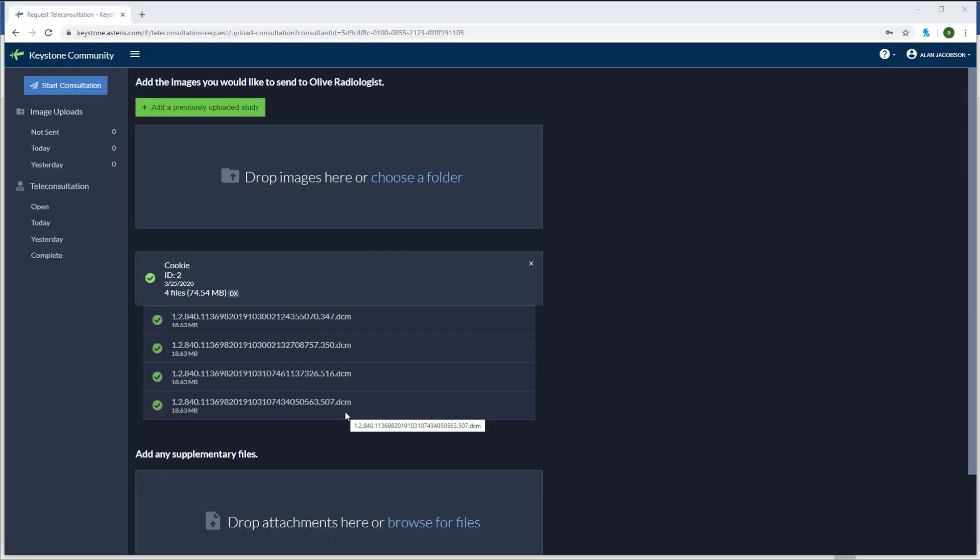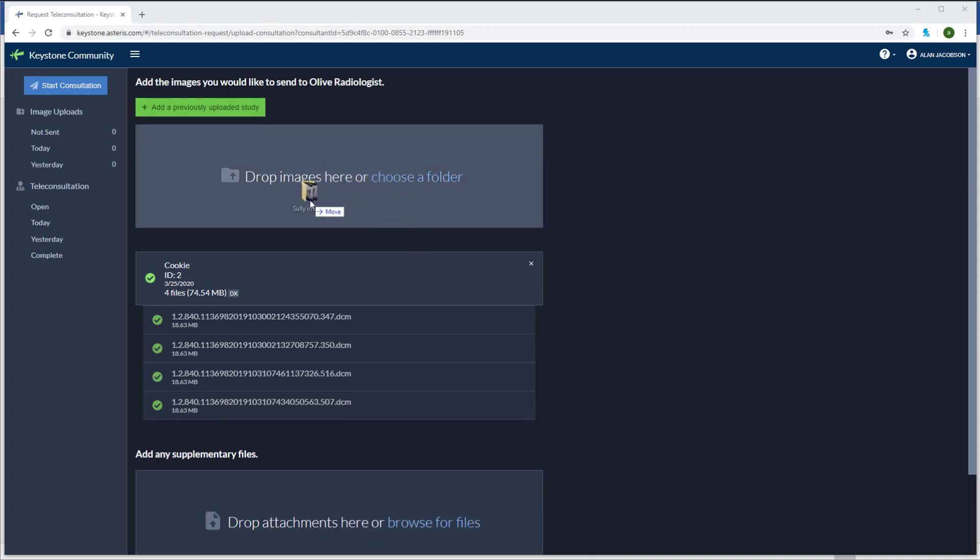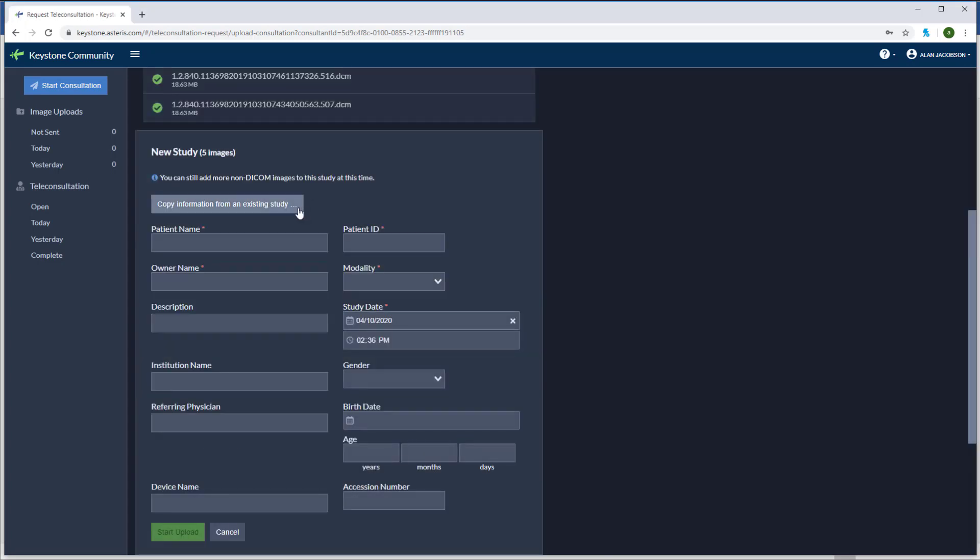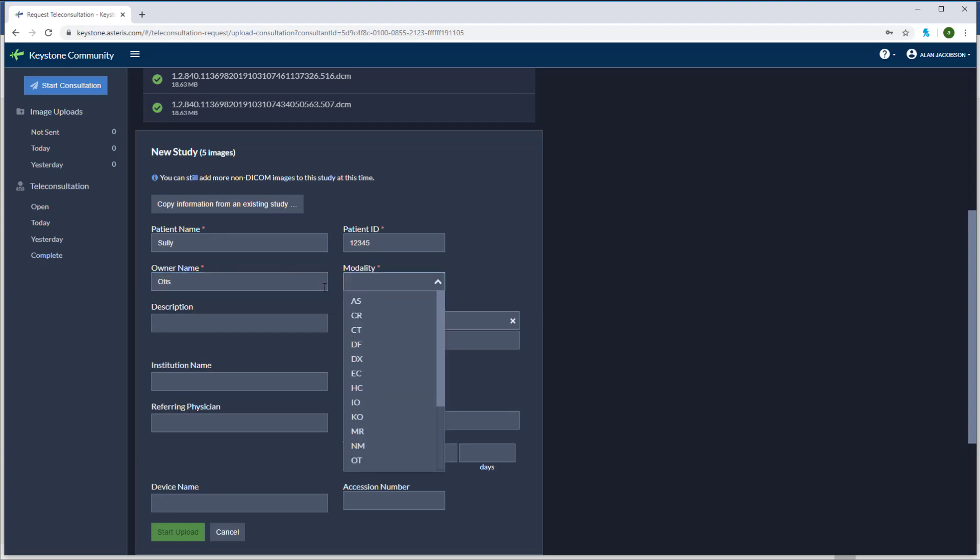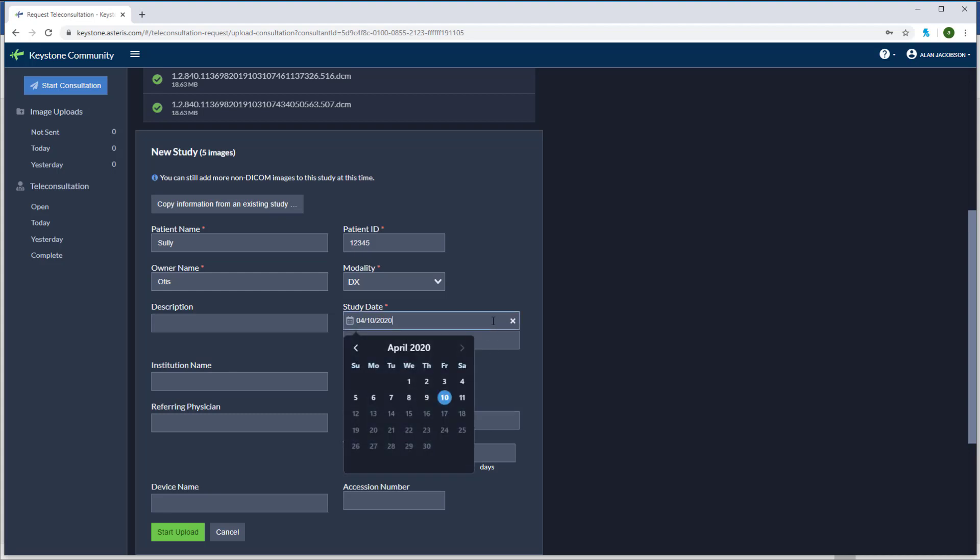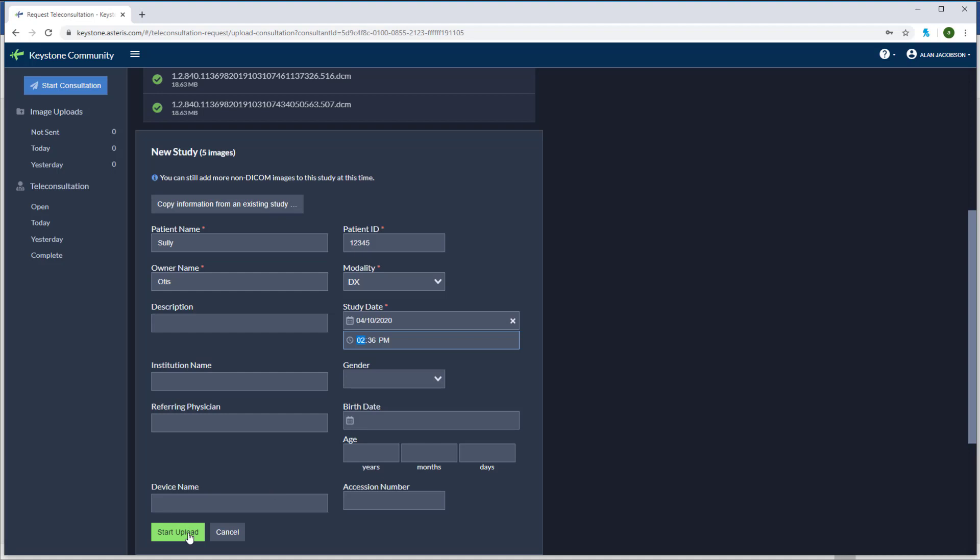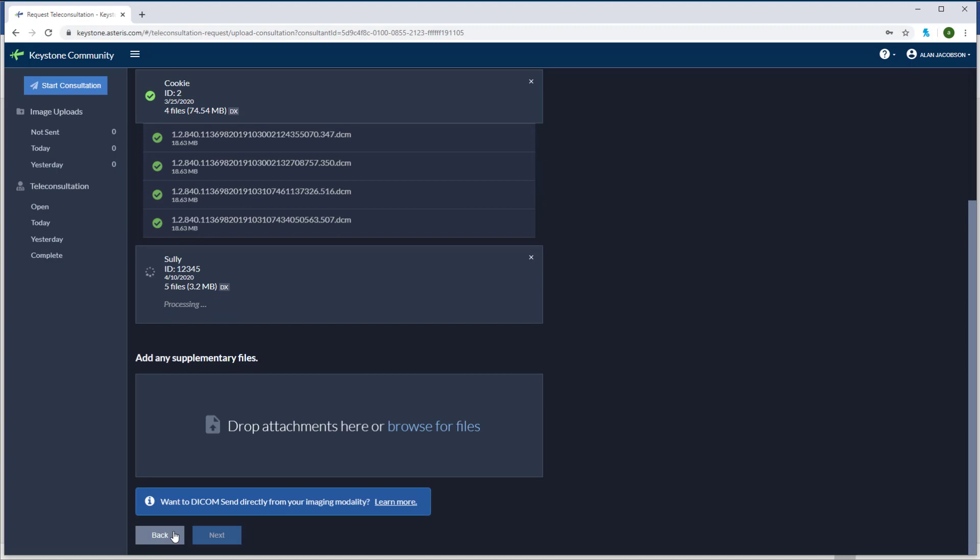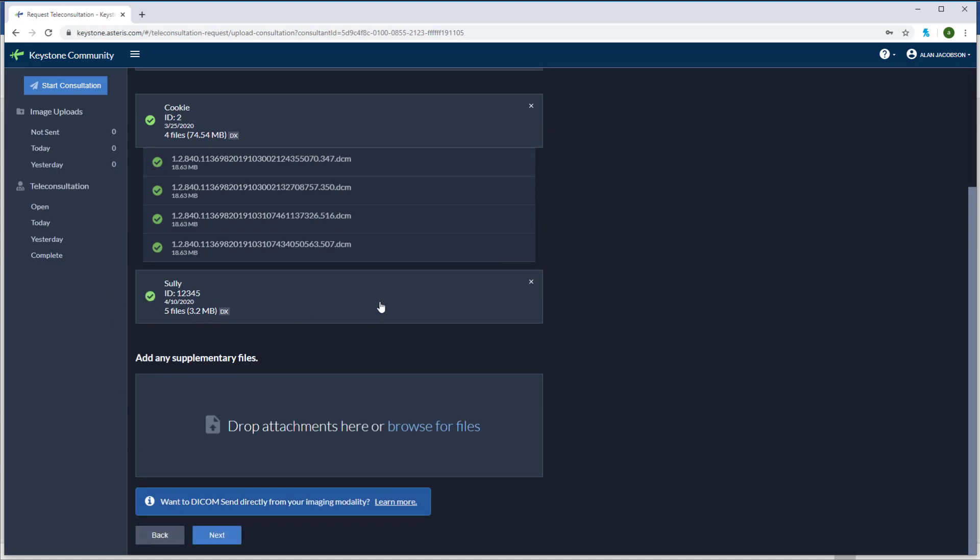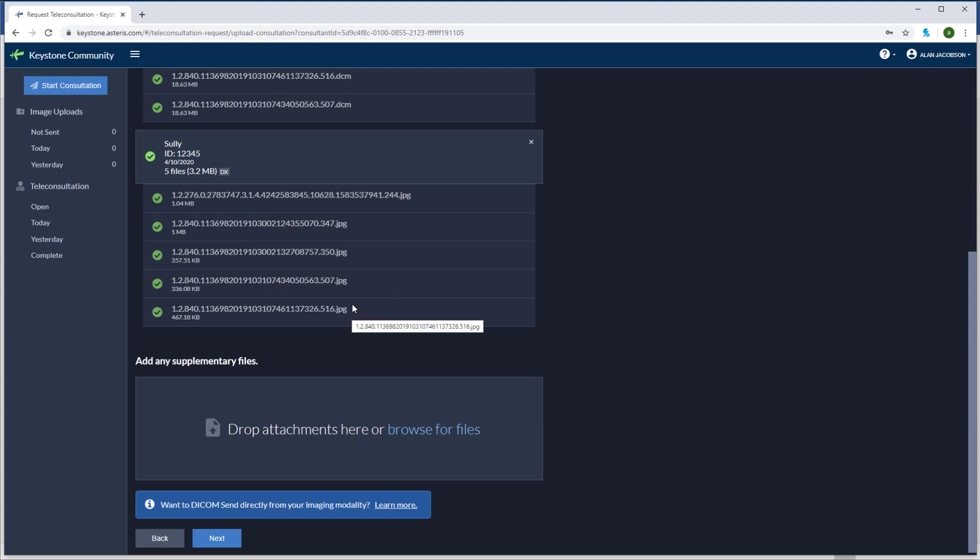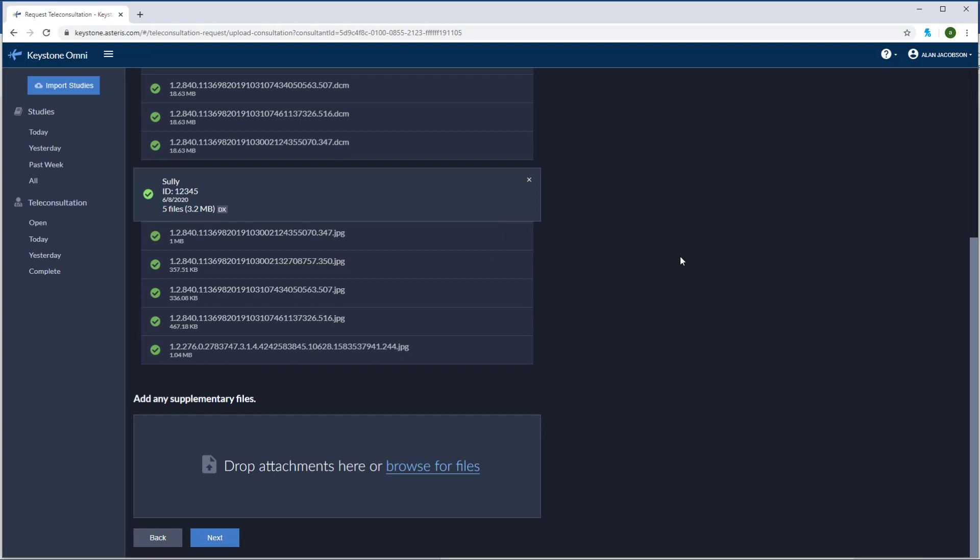Now if you don't have access to DICOM file formats you can do JPEG files. I've actually got some JPEGs loaded on my desktop so let's give this a try. Go ahead and drag and drop those JPEG images into the image access folder. You can see I'm immediately prompted with patient information that's going to be required. Modality is going to be DX for digital radiography. And the study date is already in as well as the time. Anything that doesn't have a red asterisk we don't need to enter in any information, although any additional information is always helpful for the consultant. Now you can see our images are uploading and processing. And there we go, we've got five JPEG images now loaded. A quick note on DICOM or JPEG images. Some radiology services will require that you submit DICOMs versus JPEGs. This is up to the individual consultant.